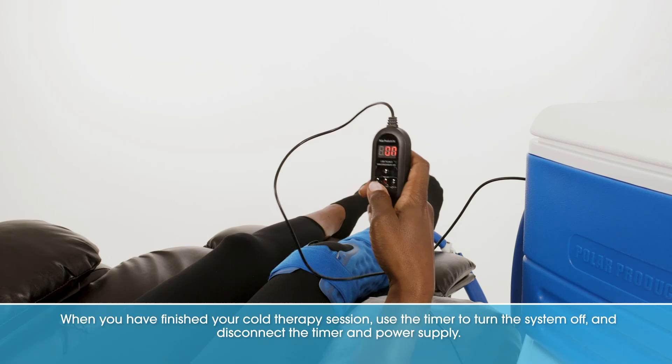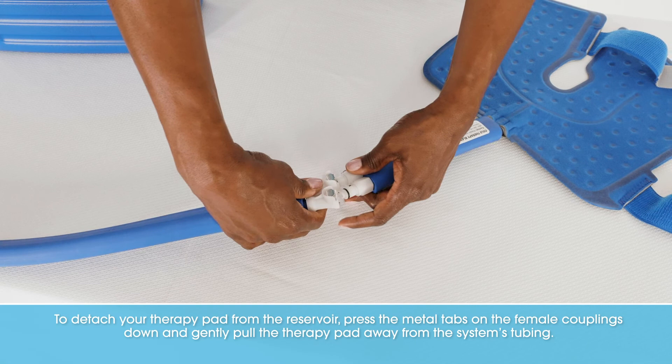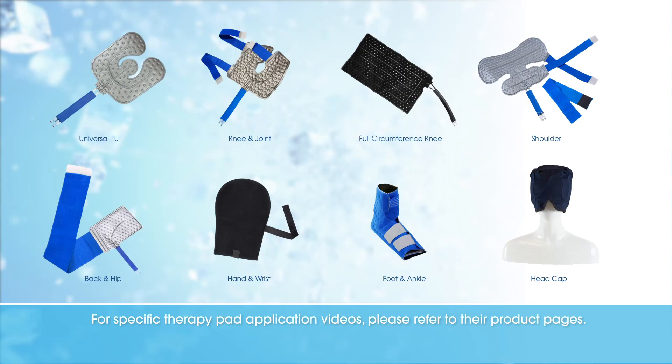When you have finished your cold therapy session, use the timer to turn the system off and disconnect the timer and power supply. To detach your therapy pad from the reservoir, press the metal tabs on the female couplings down and gently pull the therapy pad away from the system's tubing. Periodically empty the water from the reservoir and wipe down the system. For specific therapy pad application videos, please refer to their product pages.